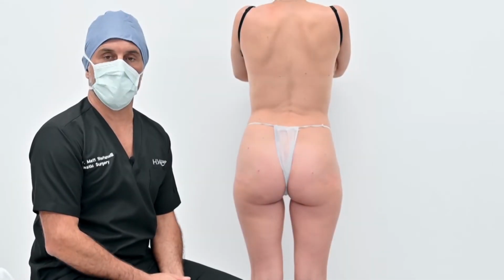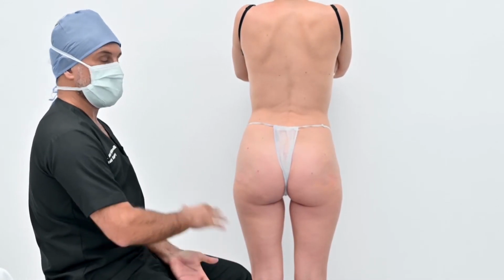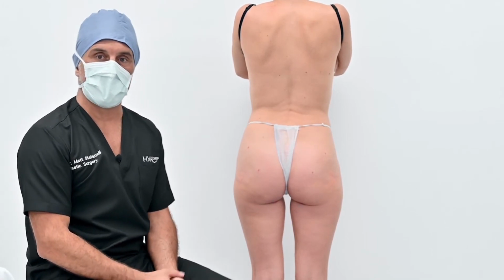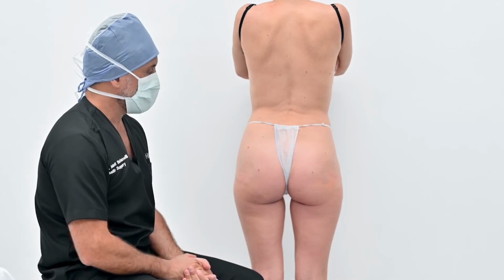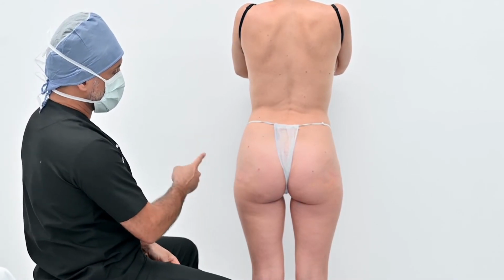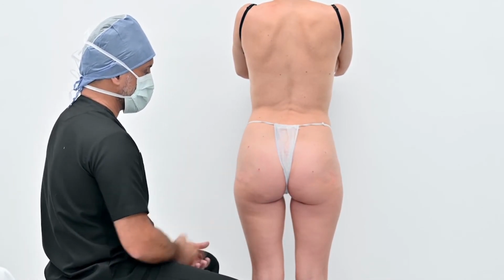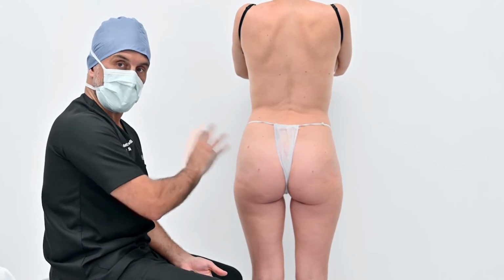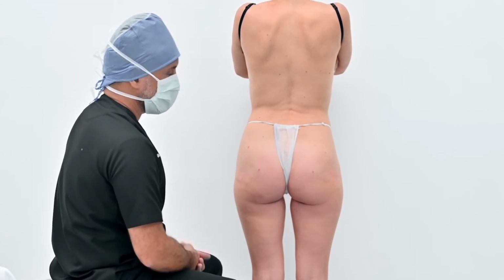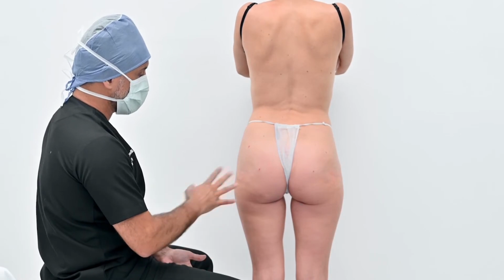Okay, so we finish the treatment. I'd like to summarize everything. We did, first of all, in a laying down position, 7 syringes on each side, and then we asked the patient to stand up for the touch-up, and it was, I think, very useful. We injected another 3 syringes on the right and another 2 syringes on the left. Total 9 syringes, 90 cc on the left, and 10 syringes, total 100 cc on the right. I'll let you now appreciate a little bit the result.